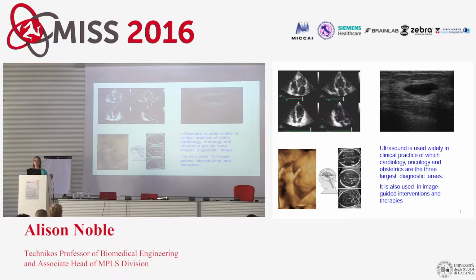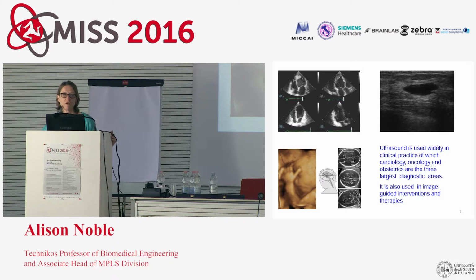So ultrasound imaging is normally the imaging modality people don't talk about. It's always been grouped together with MRI and CT and nuclear medicine, but increasingly the way you use it and the people you work with are quite different. That's because it's an interactive technology. Rather than send a patient along to put them in a tube, in the scanner, get the data back, and then get someone to interpret the data afterwards, ultrasound is done on the spot by a very skilled person. You normally call them sonographers or sonologists.